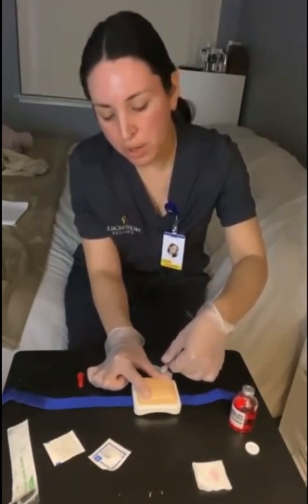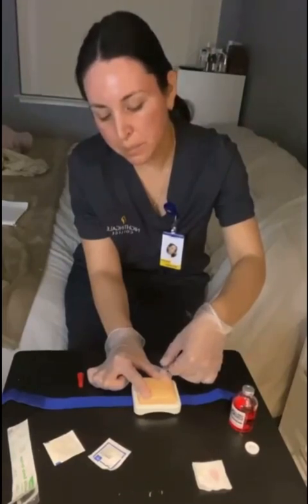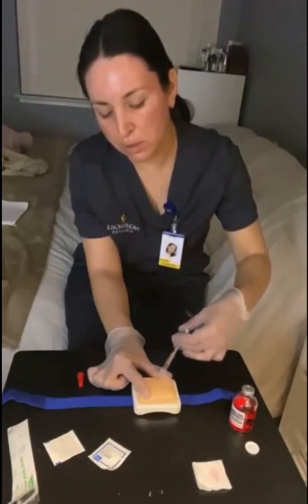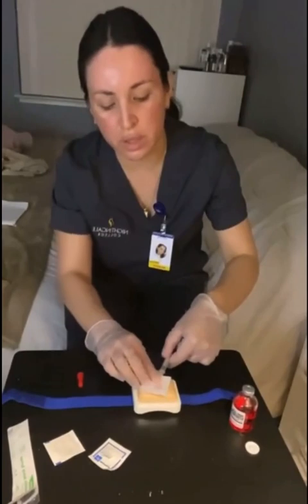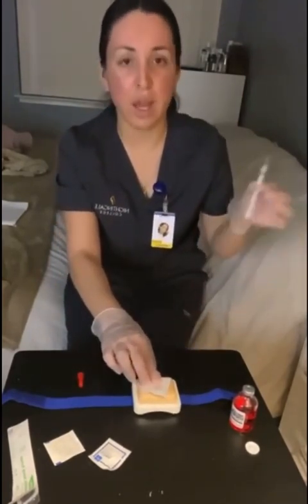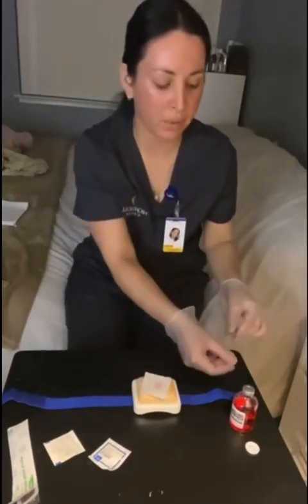So now I'm going to inject. And I'm going to inject the medication slowly. As I'm doing that, I'm going to get gauze and gently remove the needle. And I wouldn't replace the cap. I would put this in a sharps container as well as the cap.